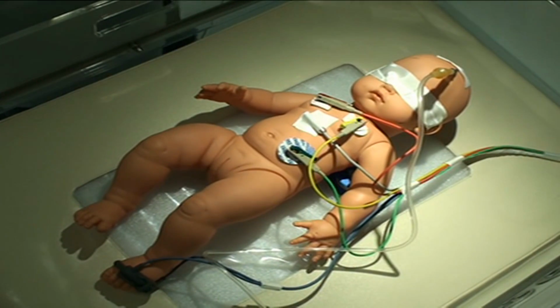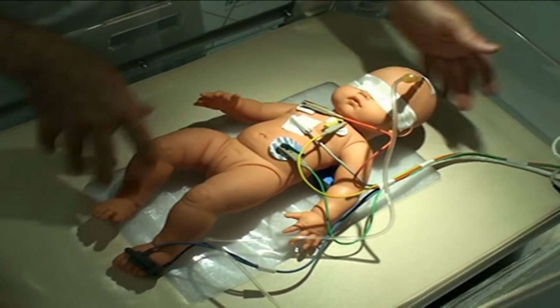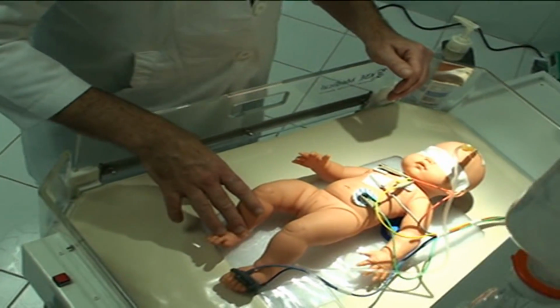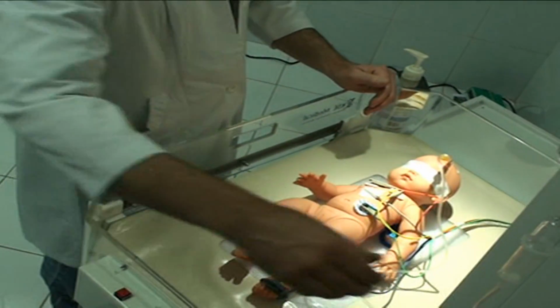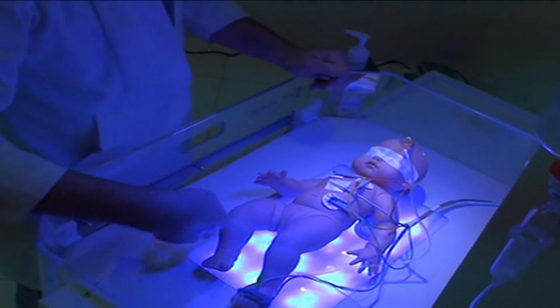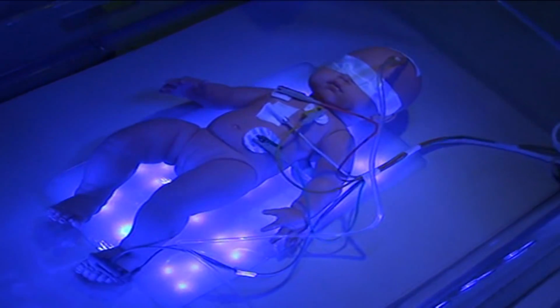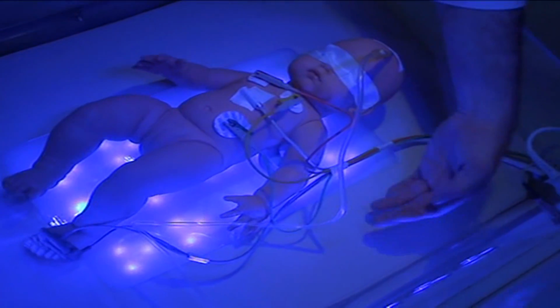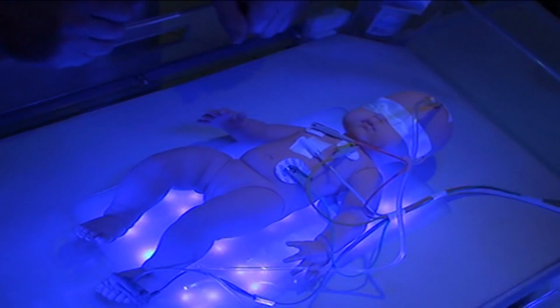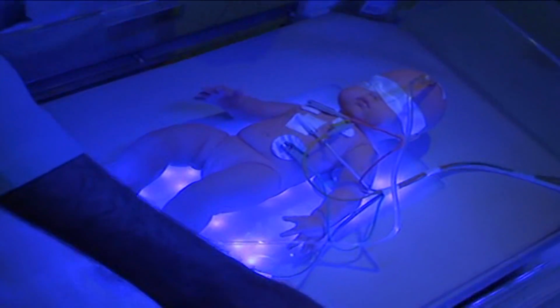Okay. So for the phototherapy, this is just a quick example of a training video. We'll place our baby in, we'll block the eyes as necessary. The baby will be denuded, of course, usually with a diaper. And then for phototherapy, for example, we simply turn on phototherapy, making sure the eyes are protected. We have upper and underside phototherapy. Each of these can be turned on or off as necessary by doctor choice. We've also got multi-axis phototherapy, so we have full light from every available position that we can. So that's phototherapy.